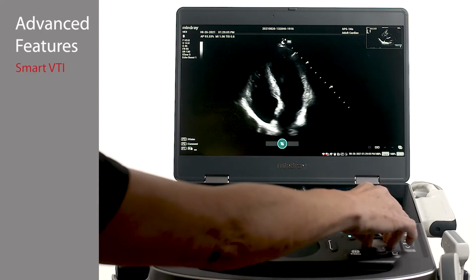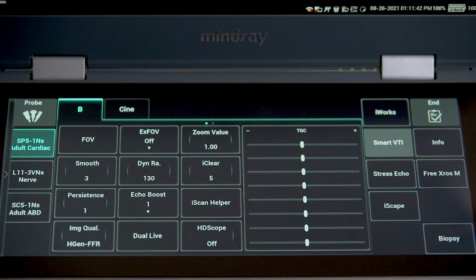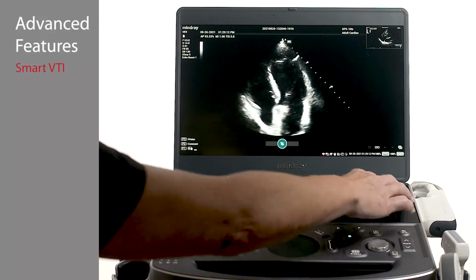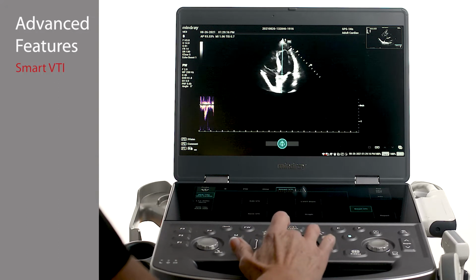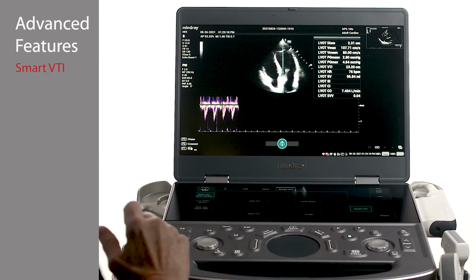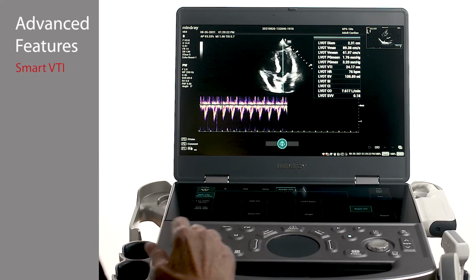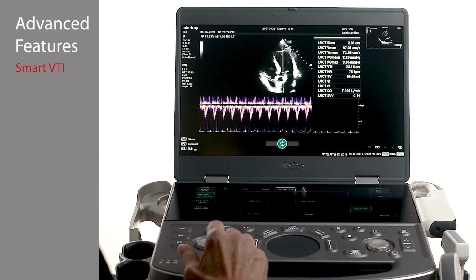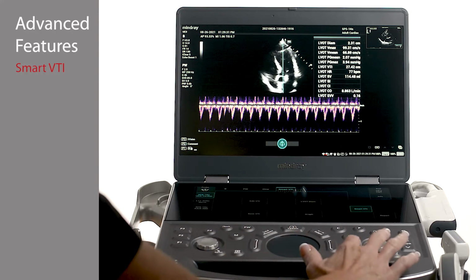Next, obtain an apical 5 chamber view of the heart and activate Smart VTI with the tab on the touch panel. The system will enter pulse wave Doppler, automatically placing the sample gate in the LVOT. Adjust the position of the gate in the reference image with the trackpad if needed. The system will begin auto-tracing the Doppler envelopes and calculating VTI, SV, and CO data.